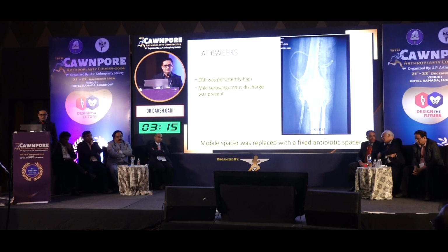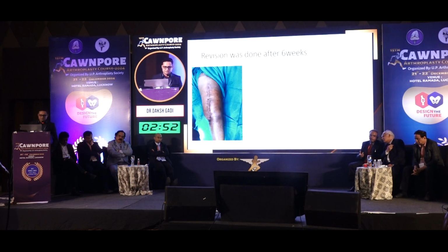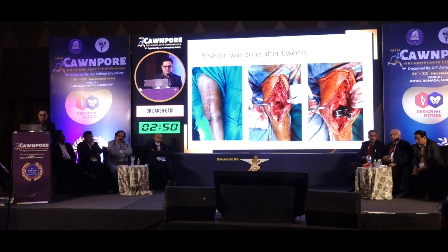So as it was being asked in the previous talk, that spacer should be replaced. So we replaced the mobile spacer with a fixed antibiotic spacer. Sometimes the mobile spacer is not very stable, like Maheshwari sir told. So in such cases, if we immobilize the patient with a fixed spacer, chances are the infection may heal better. So after that, the revision was done.